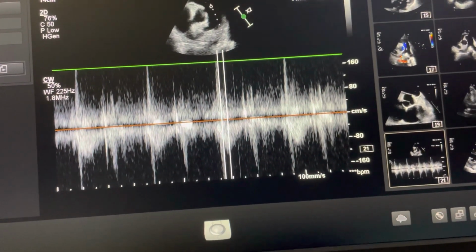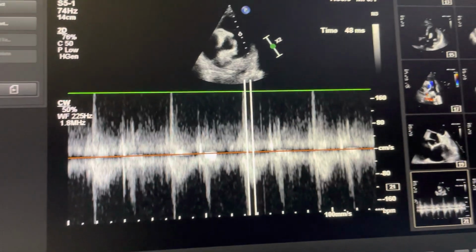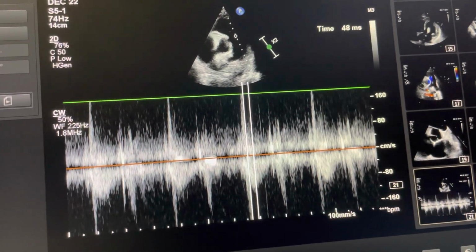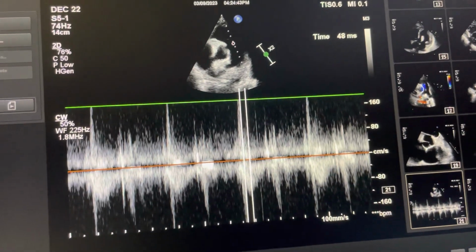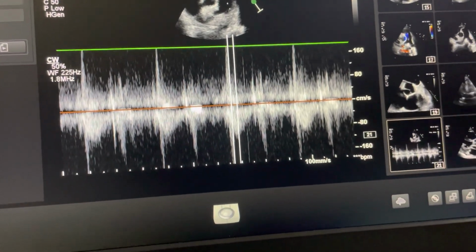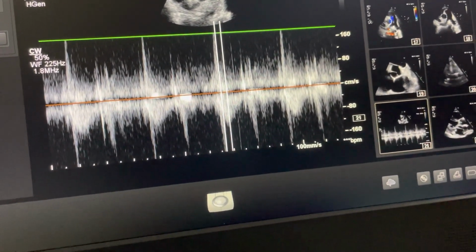And a pulmonary artery flow has acceleration time less than 60 millisecond and pressure gradient across tricuspid valve less than 60 millimeter of mercury. That is called 60 by 60 sign. This finding is history of pulmonary embolism. Here see flow across pulmonary valve, acceleration time is 48 millisecond, that is less than 60 millisecond. This is the 60 by 60 rule seen in case of pulmonary embolism.